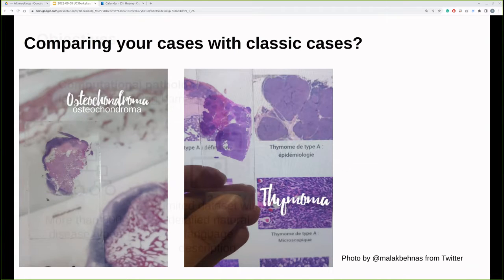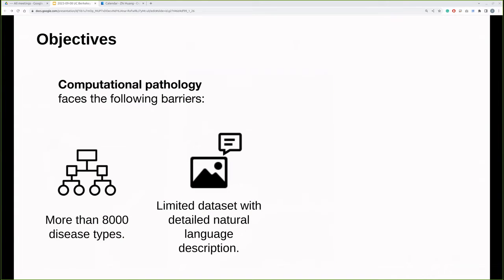And we believe the answer is yes, because the recent advances of pathology AI algorithms can help us distinguish cells or tissue types, generate diagnosis, and retrieve relevant images. Those pathology AI could be very useful for us to advance pathology in both diagnostics and education. However, I have to mention that in my opinion, the progress in computational pathology has been heavily constrained by the need for more diversified data sets, including well-annotated labels in natural language.